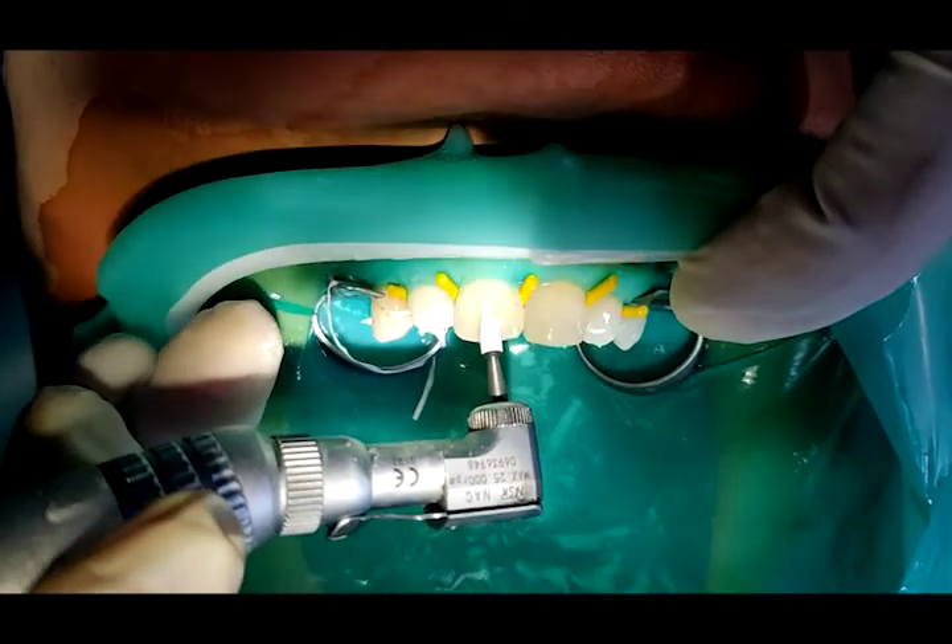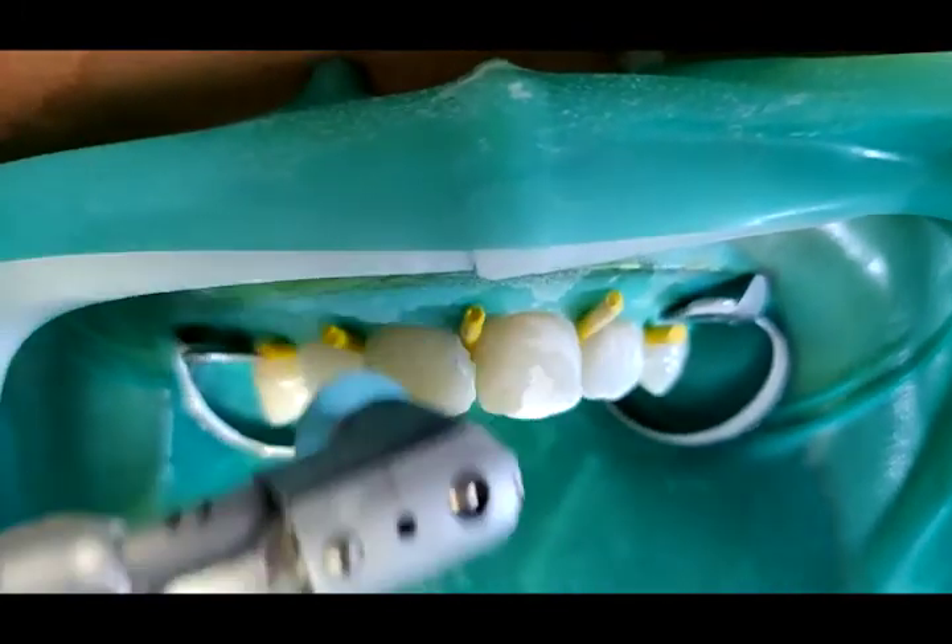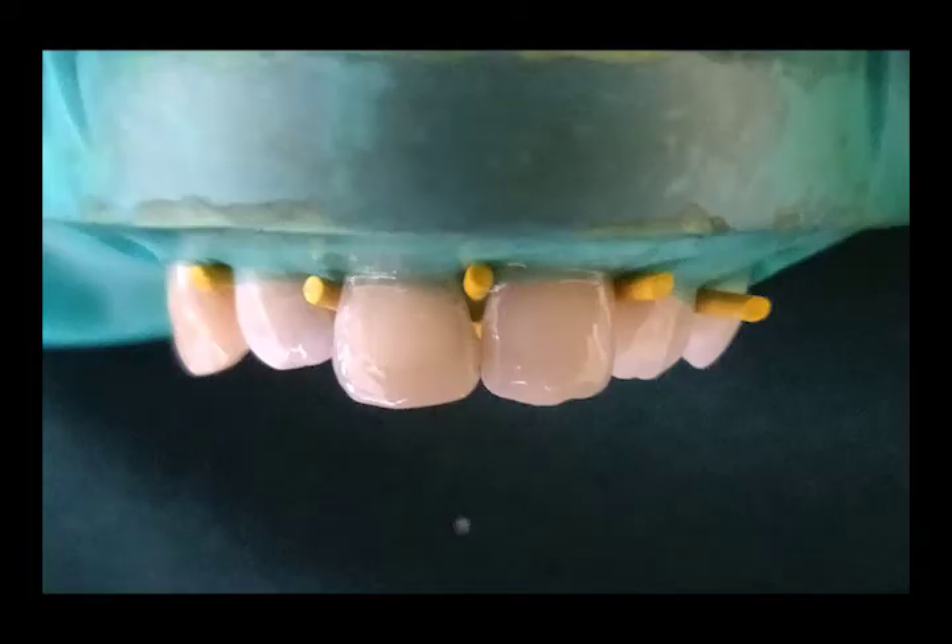Bur finishing was done with the Shofu Diamond Finishing Kit, and final polishing was done using the Sof-Lex Polishing Kit.